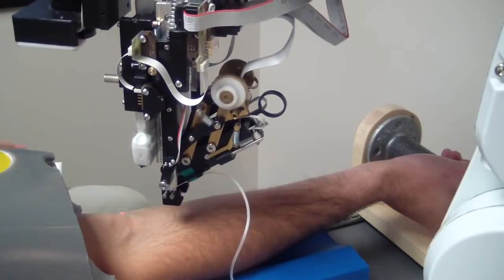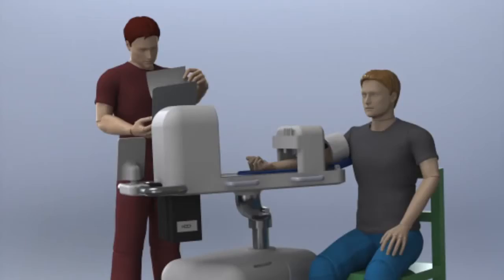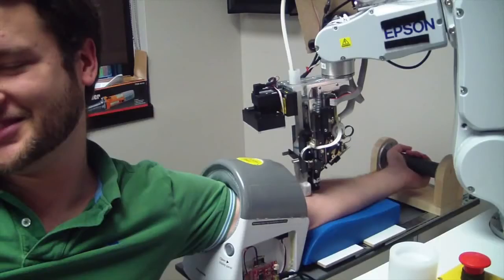But what makes V-Bot better than a human technician? It still needs a human to start the process, and the idea of a robot drawing blood may be too creepy for some patients.